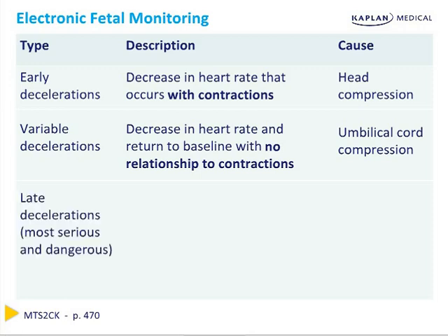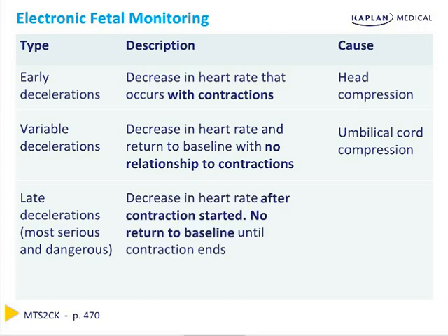Late decelerations are dangerous and serious signs, and they occur with a decrease in heart rate after a contraction is started, with no return to baseline or a slow return to baseline after the contraction ends. This represents fetal hypoxia as a result of uteroplacental insufficiency.